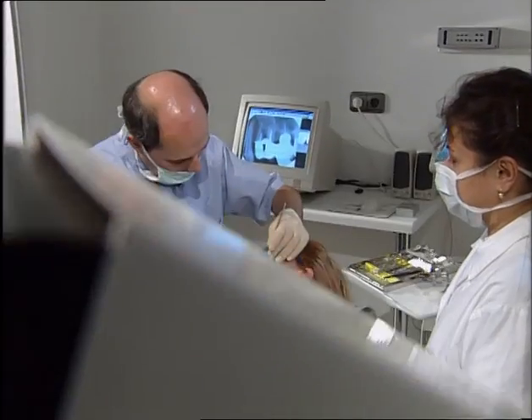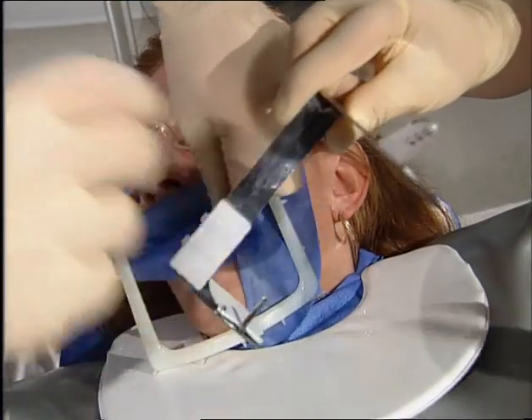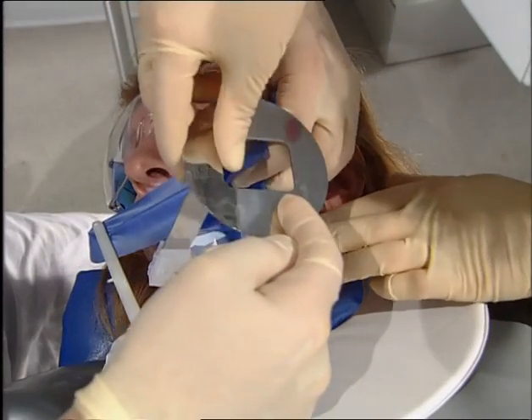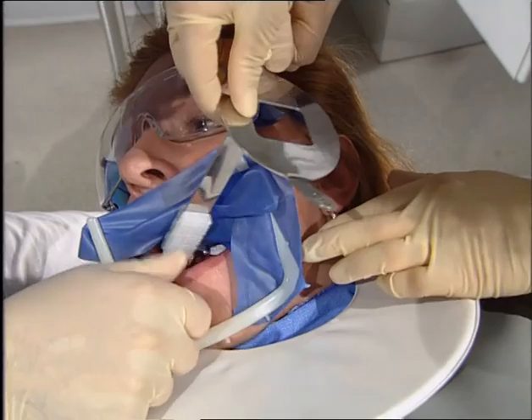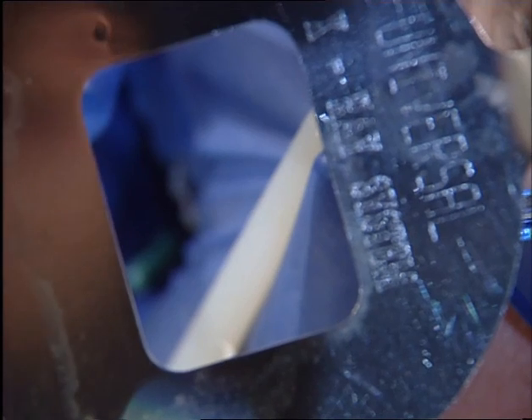The working length can now be checked with a radiograph. In order to get reproducible, high-quality films in the paralleling technique, the so-called beam guiding instruments can be used. They consist of a large and a small diaphragm, reducing the radiation exposure significantly.